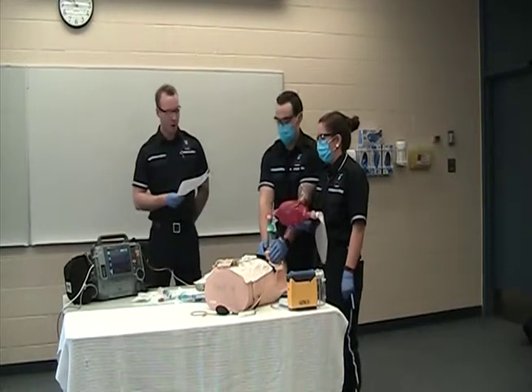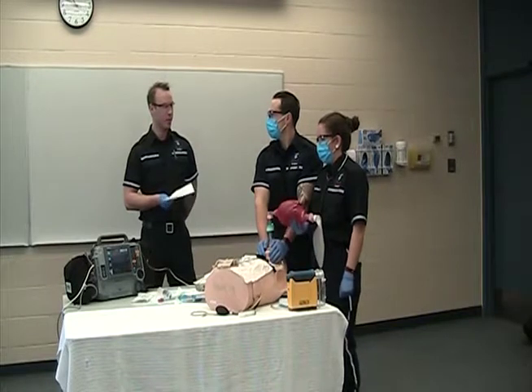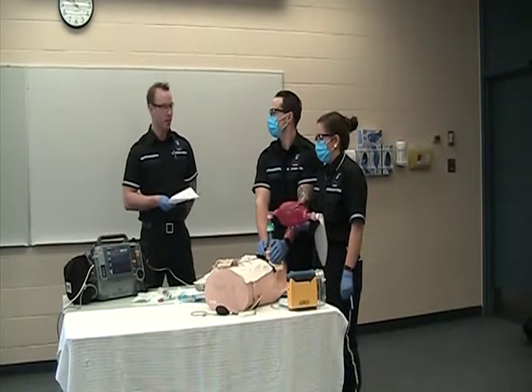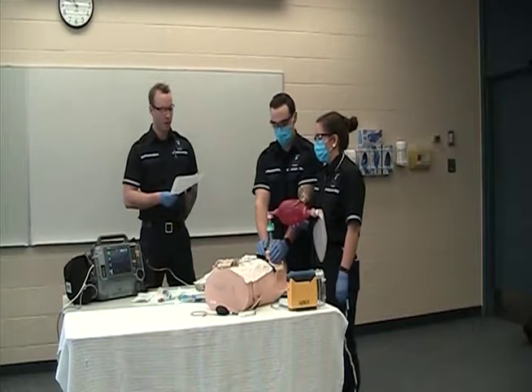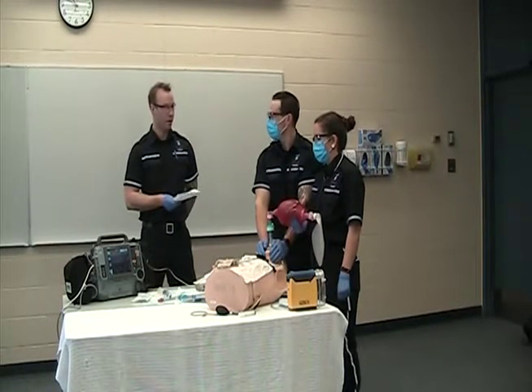So I'll read this off to my partners here. Patient has been assessed for the level of difficulty. We've done the LEMON assessment. Patient is prepared. We have our NRB, BVM ventilations. In this case, we're going to be doing a BVM ventilation, two-person, with nasal cannula at 15 liters per minute. Oxygen is flowing.